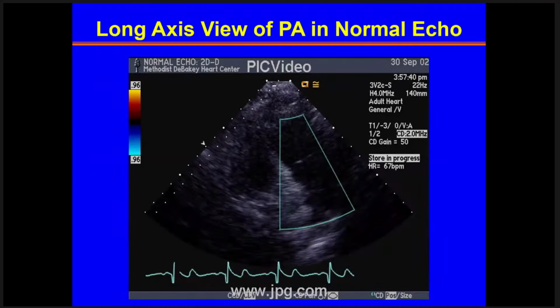We can do the same for the RV outflow tract. The RV outflow tract is more challenging in measuring its outer border, as you see in this slide. And in the older days, when they were looking at validating these measurements, if you were to use an angiogram that gets you the RV outflow tract along with the pulmonic valve and the rest of the pulmonary artery and use that to acquire the diameter, you end up with very comparable values to the real flow.